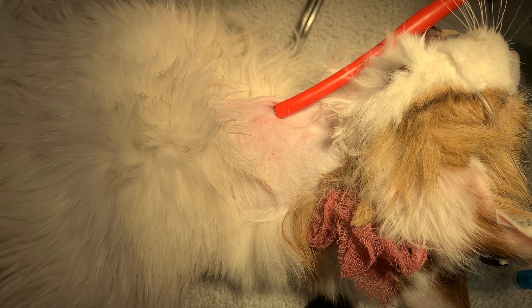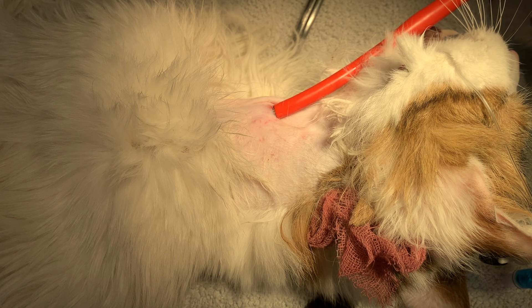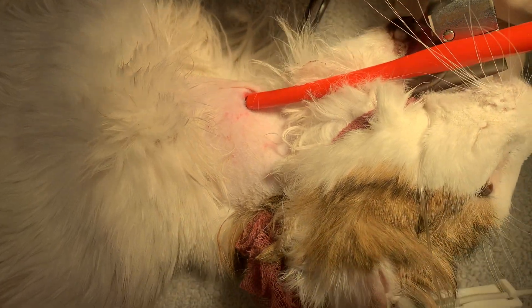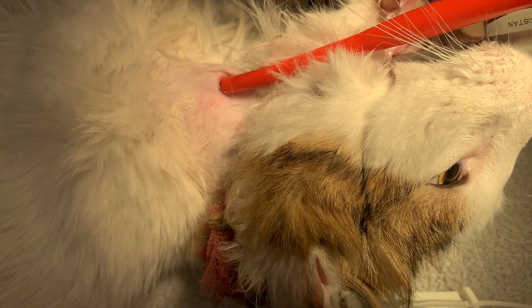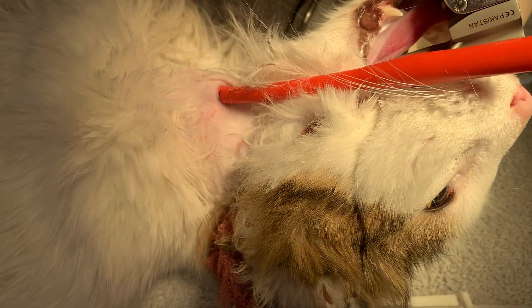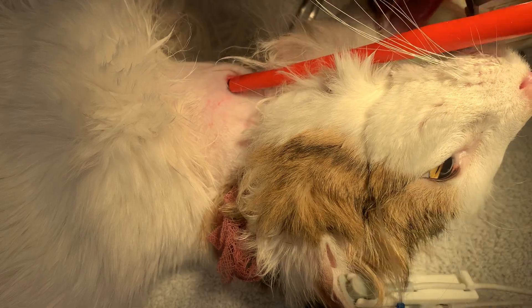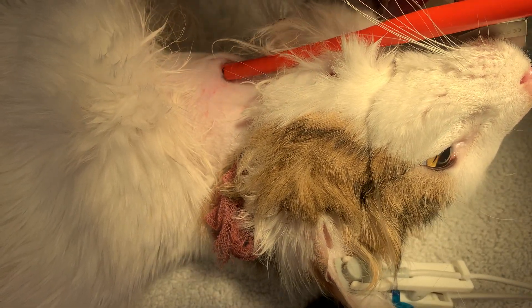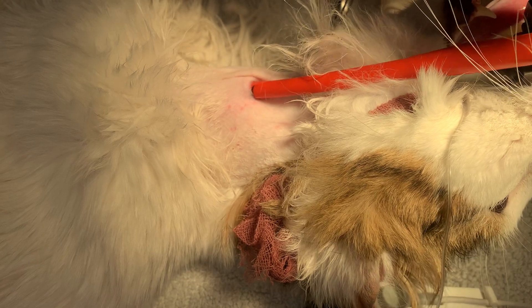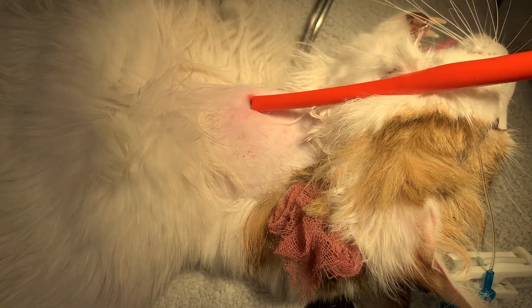Now we need to check placement. We have a laryngoscope right here — just to make sure we didn't end up going sub-Q with it or something. I can't see it going anywhere else, so we should be good there. Now we'll suture it into place.